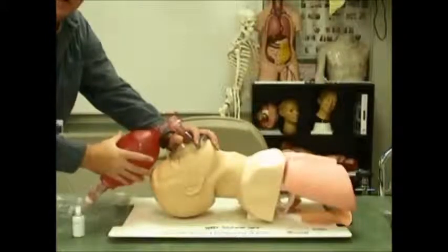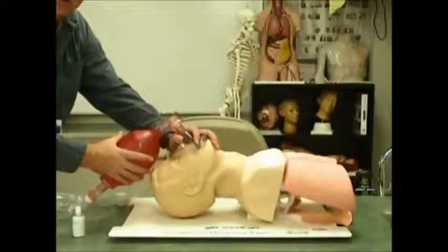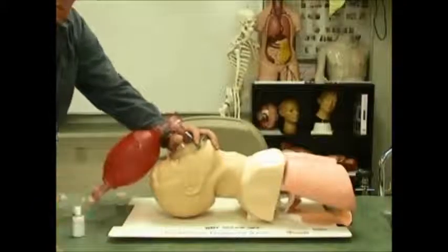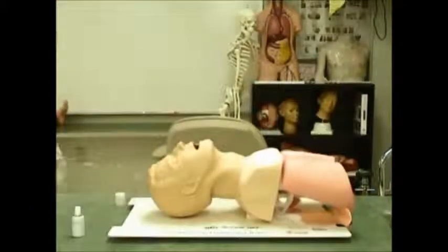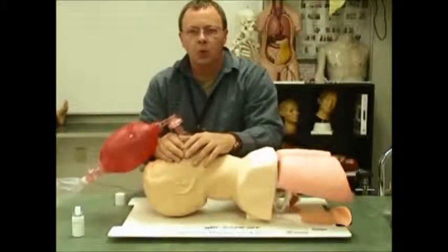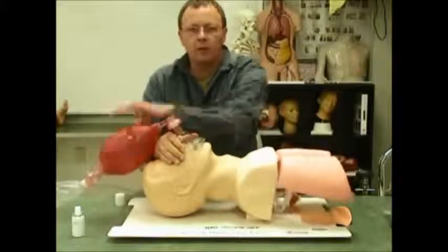One one-thousand, two one-thousand, three one-thousand, four one-thousand, five one-thousand, six one-thousand. A two-rescuer technique may also be utilized, where one rescuer makes the seal with two hands while the other ventilates.